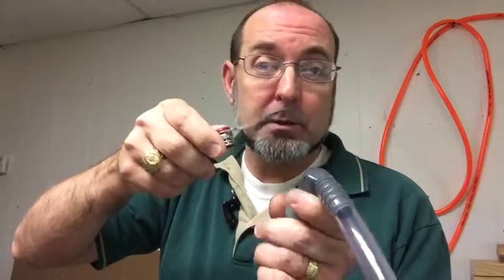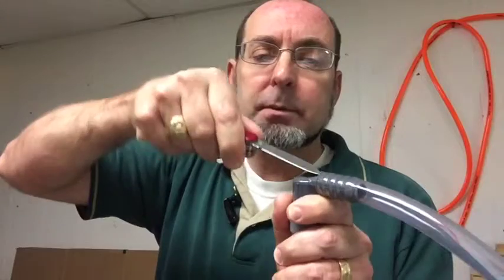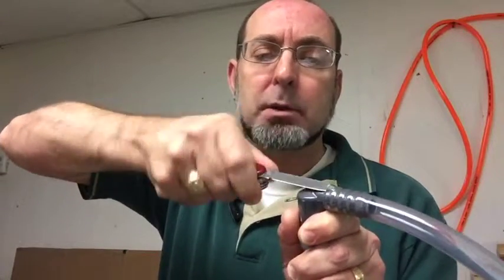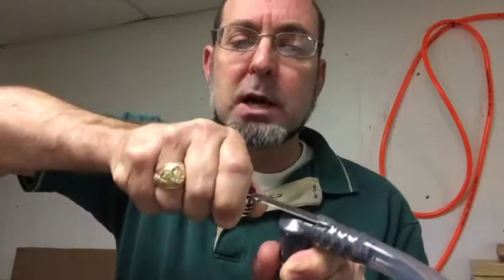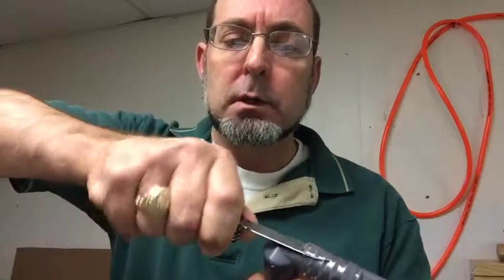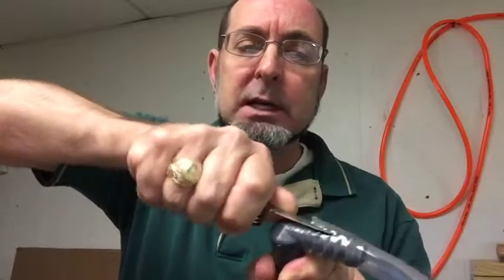A scalpel is probably better because it's going to be sharper than even my knife, and just work the tip of the knife under that plastic. Keep it kind of flat so that you're not cutting into the connector, and of course, the Boy Scout mantra, always cut away from yourself. Just work that knife blade down there and cut the tubing that way. That way you don't damage the connector and you can pull it right off.